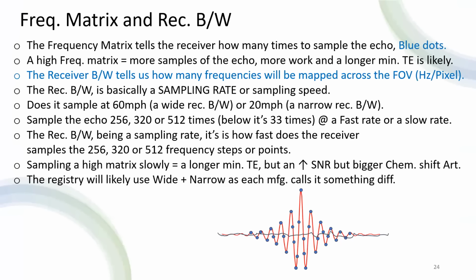Okay. Receiver bandwidth and frequency matrix. We're almost done with this one, guys. We'll be taking a break in a few minutes.